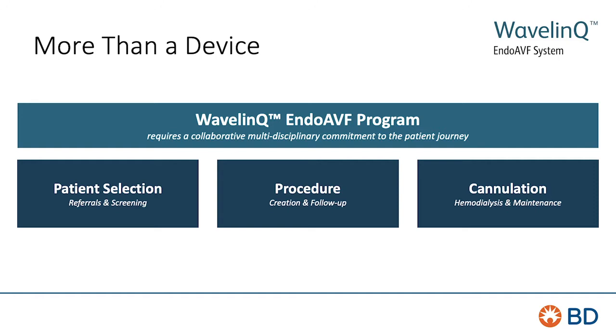In addition, we discovered early on that bringing our ultrasound team into the operating room and upgrading our ultrasound experience in the operating room became essential for creating fistulas with a high degree of frequency.